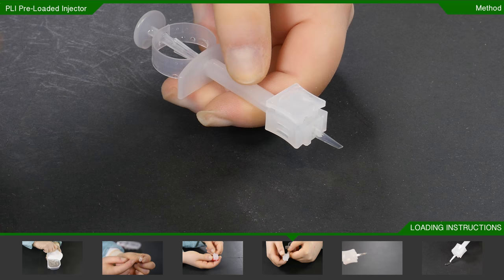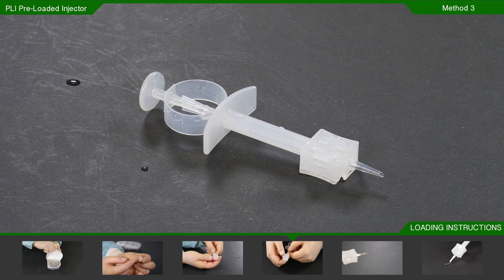Place the PLI on the sterile table with the loading tab facing down and press firmly on the PLI body. Whichever works for you. Either of these three methods is fine.